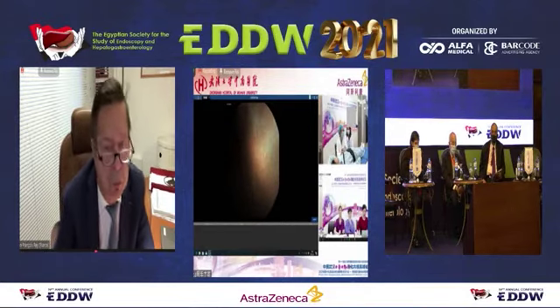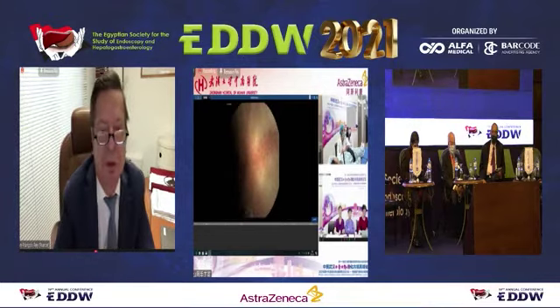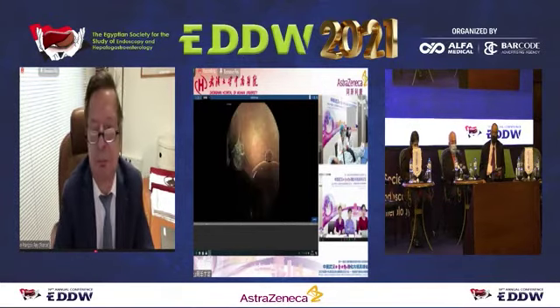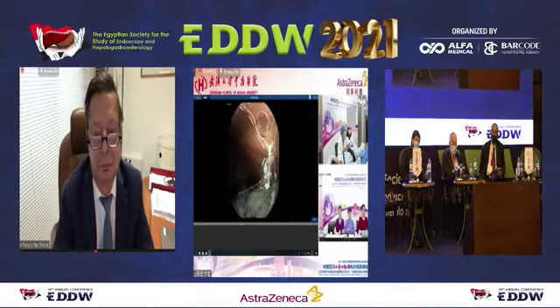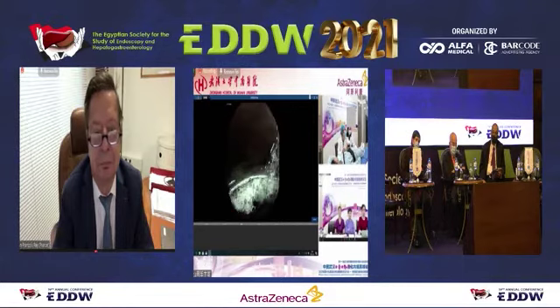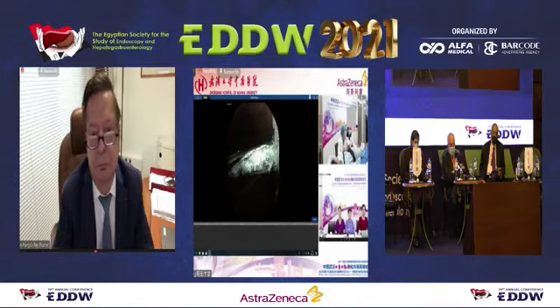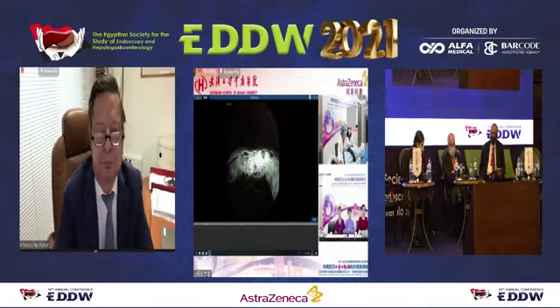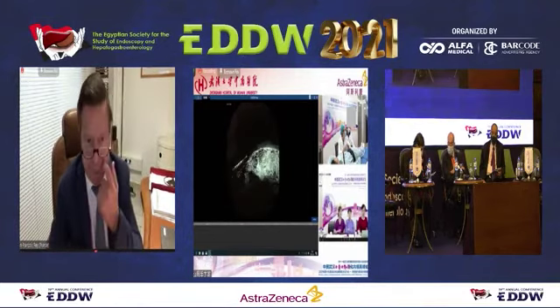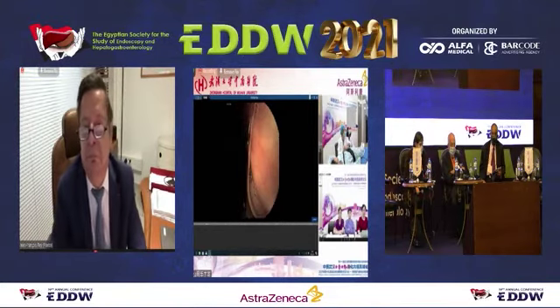Yes. How long does the procedure take? About 20 minutes? Or can it be a short procedure? In the study we did, about 15 to 20 minutes. It's longer than gastroscopy. Actually, Dr. Zhou has finished the procedure, and we usually do the procedure in less than 30 minutes. Yeah, agree. Okay, thank you.